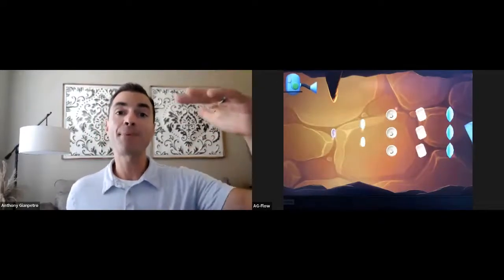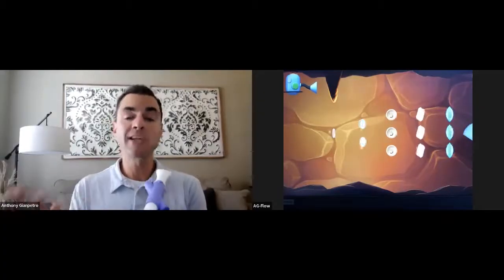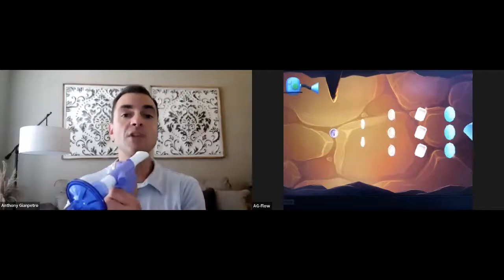You'll notice that that stalactite was popping out of the ceiling because you selected the next mode, not volume only, but where you want the patient to generate a proper pressure first, meet a minimum before they can start successfully doing the activity. So notice it doesn't really matter how hard I breathe in. I just need to breathe in a minimum amount before I start to collect the coins and meet the volume that I have programmed. So notice what this looks like.